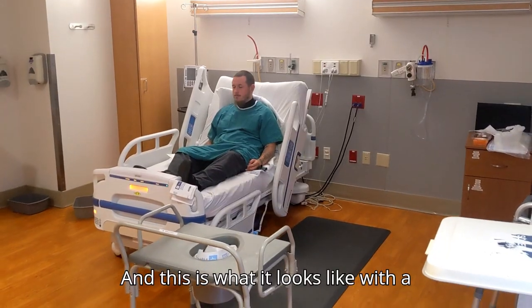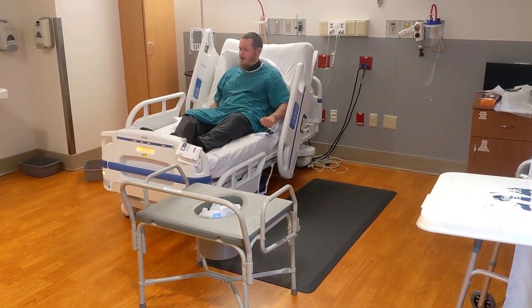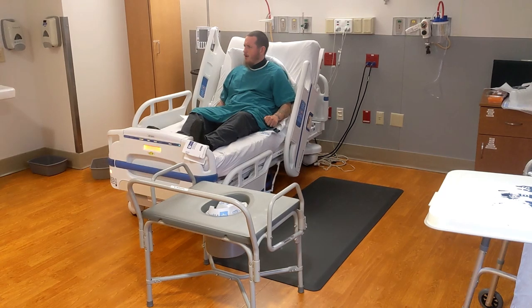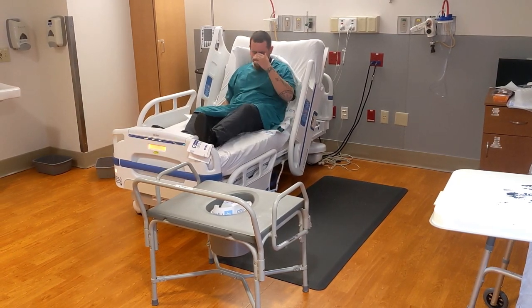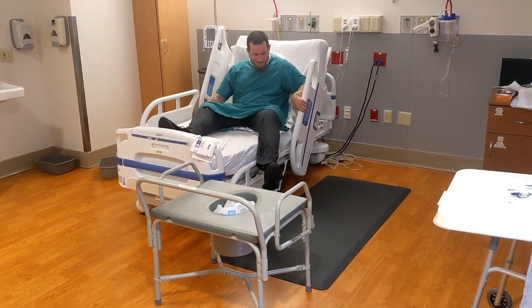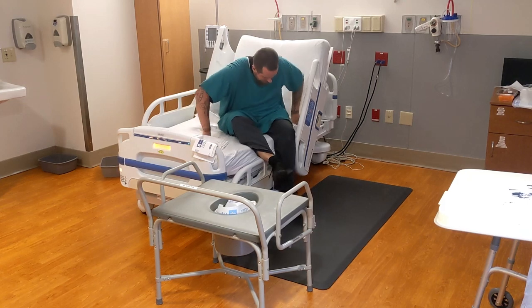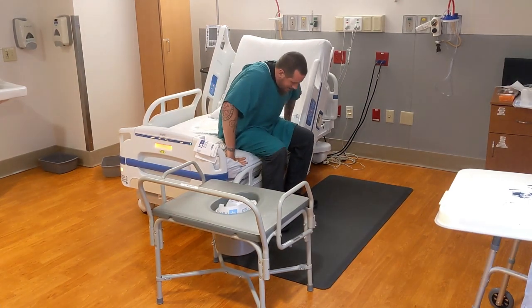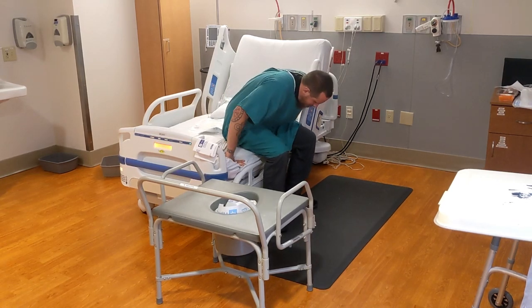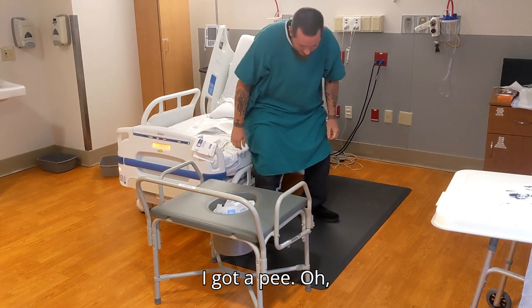And this is what it looks like with the fall mat. Nurse! Nurse! I gotta pee! I gotta pee, nurse! Oh, heavens!